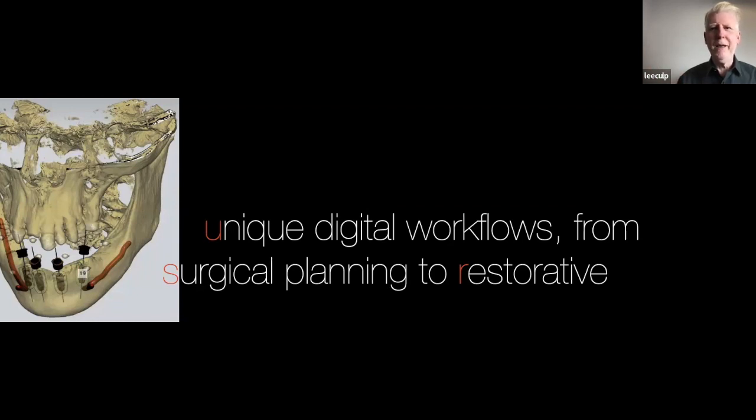We just make you a new denture and send it back. The labor is probably less to make an entire new denture than it is to try and jig it and reline it and repolish it and do all that stuff. And just a thought, that's true. Just keep with the digital workflow.